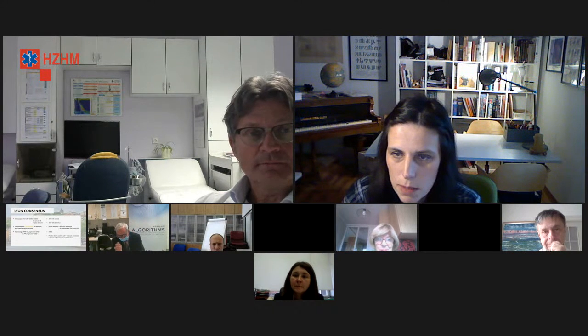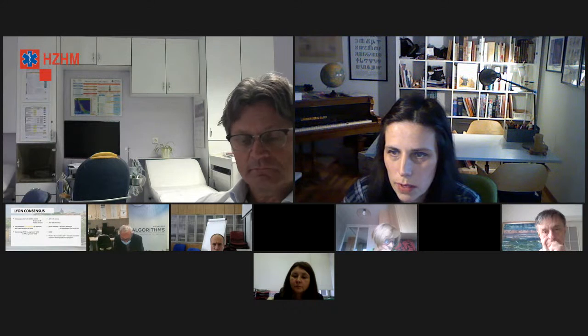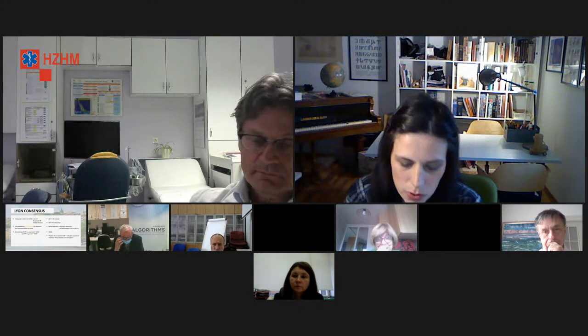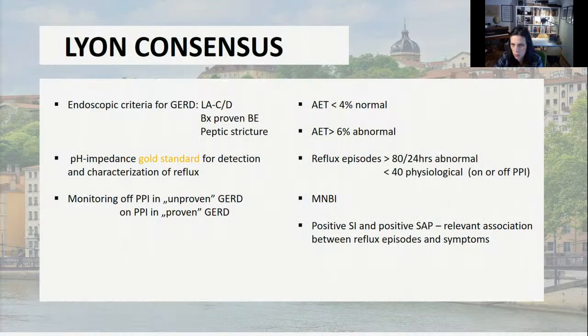Ono s čim se mi u dnevnoj praksi, moji mlađi kolege i Maša i Mislav i ja, uvijek pitamo, recimo, ova siva zona. Znamo da je normalna ekspozicija distalnog jednjaka kiselini ako je manje od 4% ukupnog vremena. Znači, nas često muči ova brojka između 4 i 6.